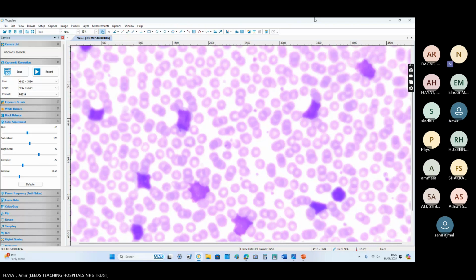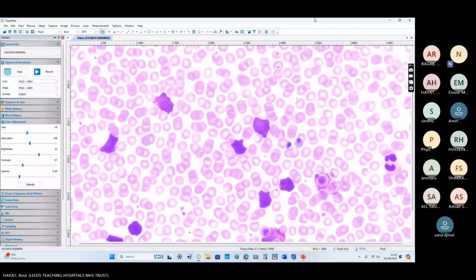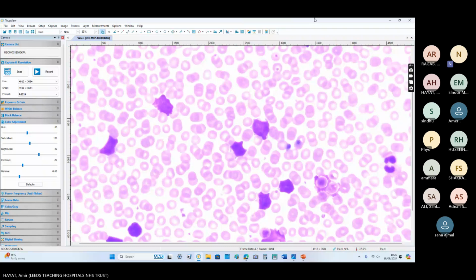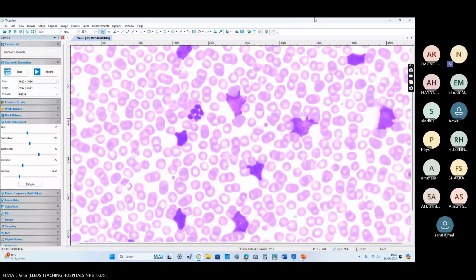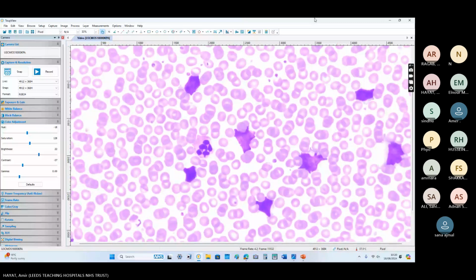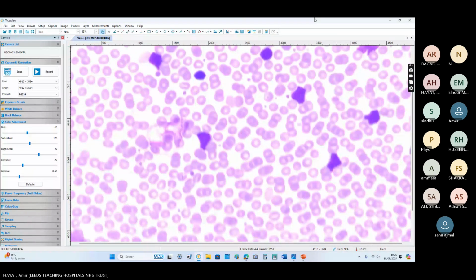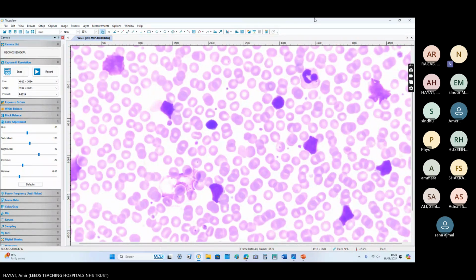So the blood film shows leukocytosis with a predominant population of mature looking cells, which are variable in size and have irregular nuclear contour. They have a high NC ratio and their nuclear chromatin is condensed with no prominent nucleoli. The neutrophil count seems to be preserved.